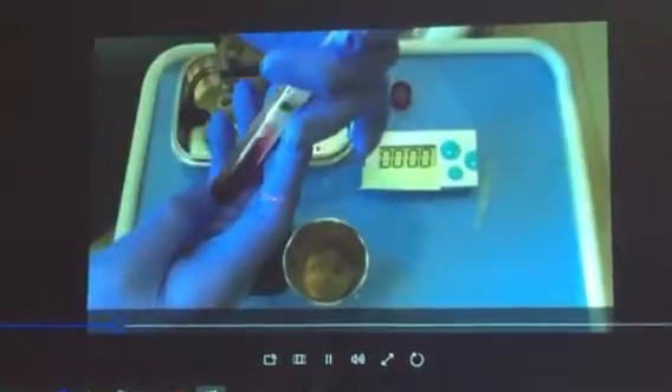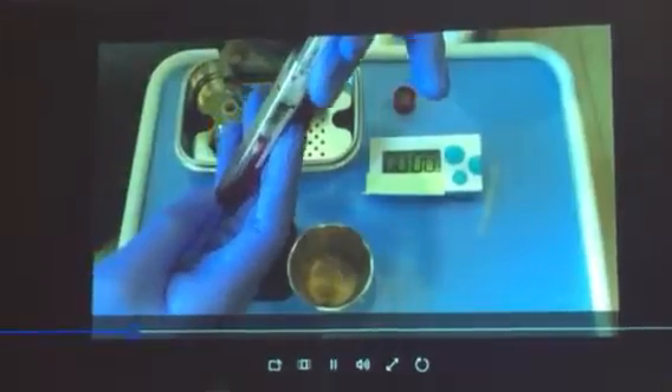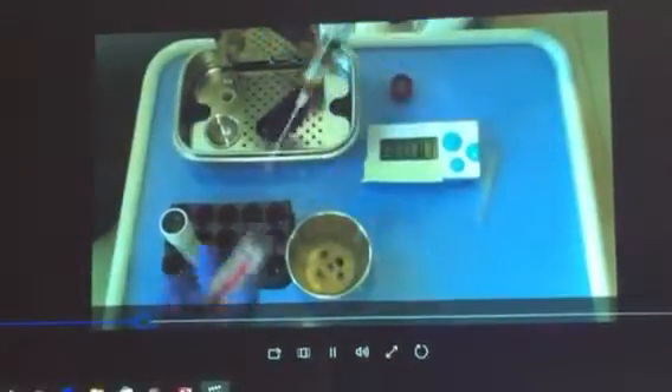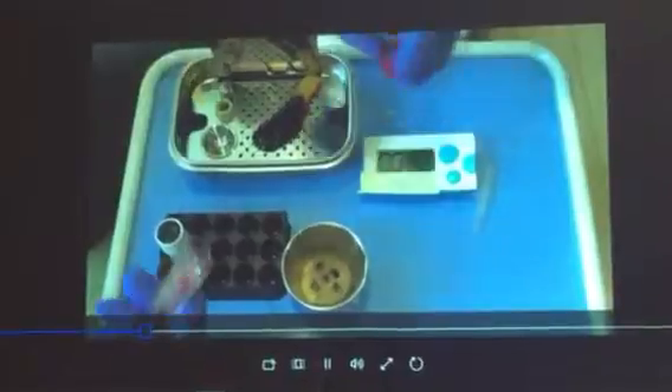See how I'm getting it at the bottom here? You only need a couple drops, that's all you need. Why not blood from the white tube? It's not going to work — we tried it. I've added about five drops. I've tried everything; it doesn't work. It's got to be from the red.